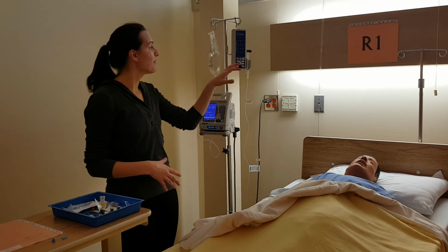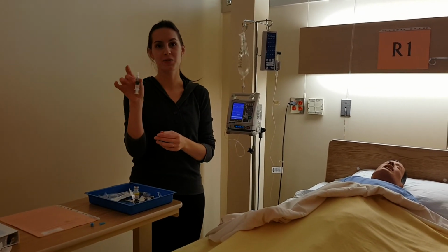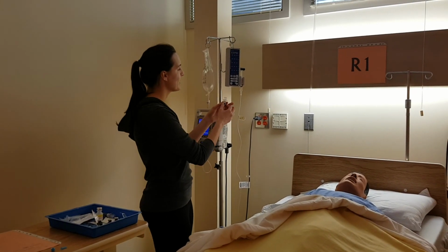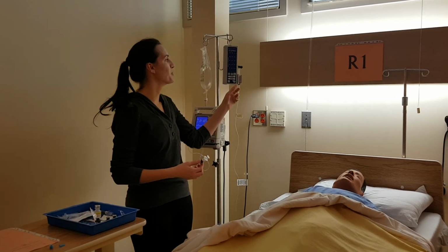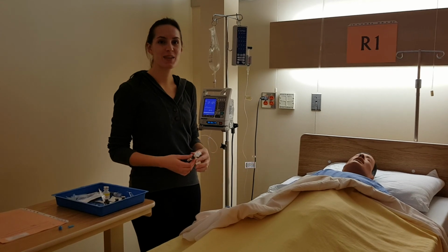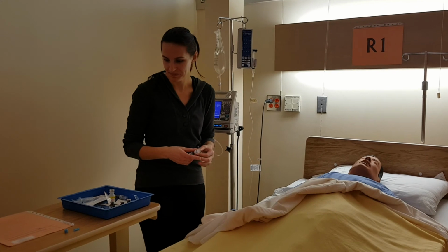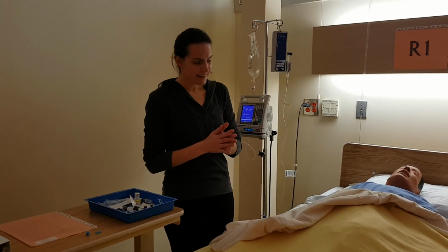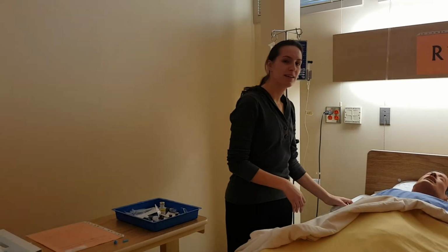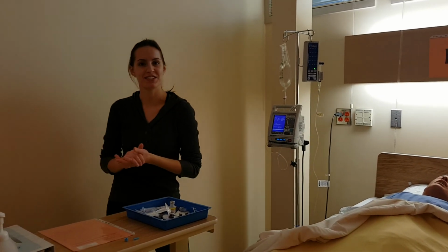When I come back, after 15 minutes, when this is done, I'm going to come back with a 3 milliliter normal saline syringe, and I'm going to connect it to the tubing and allow it to run at the same rate, which is normal. This ensures that all the medication in the line enters the patient so they get the correct dosage of medication and hopefully the full effects of that medication. And label onto my tubing. So I've documented, I've ensured that my patient's in a comfortable position, the call bell is in reach, and as I exit the room, I would do an exit safety check.